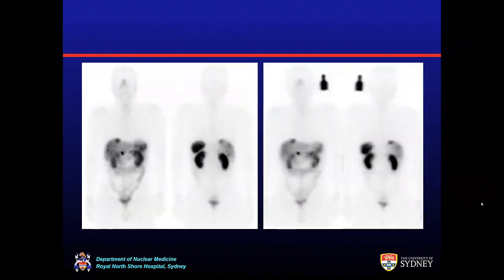Here we have an example of the difficulty assessing specific lesions, as well as erroneous disease localization, specifically of the liver and upper abdominal lesions. Here, there is a possibility that there is some subtle lutetium avidity within segment 6 of the liver on the anterior images, which is not well demonstrated on the posterior images.